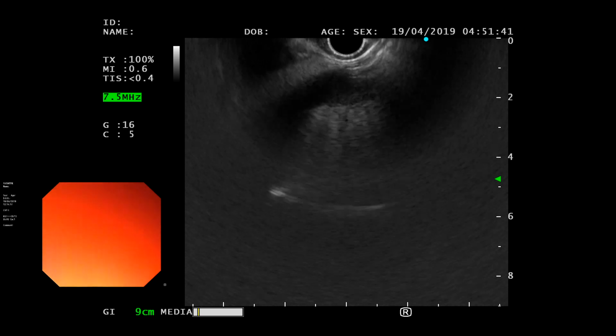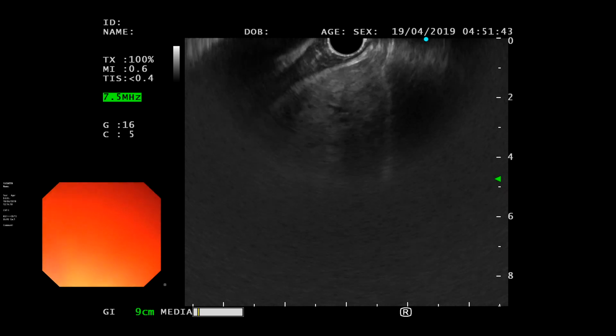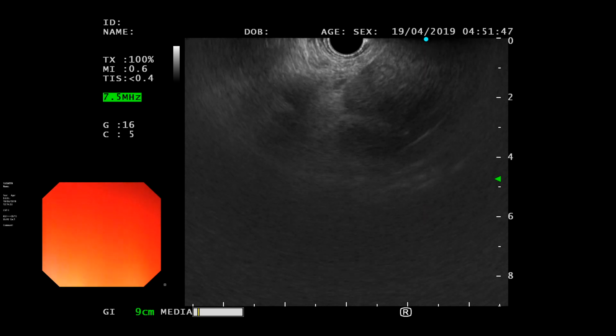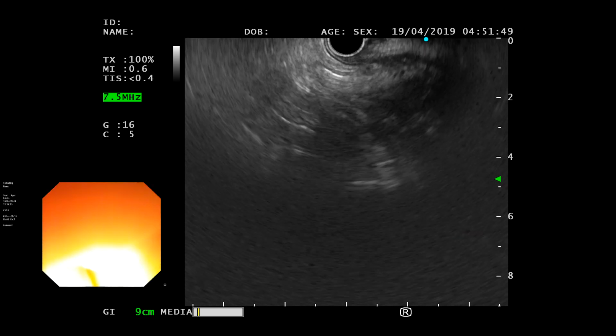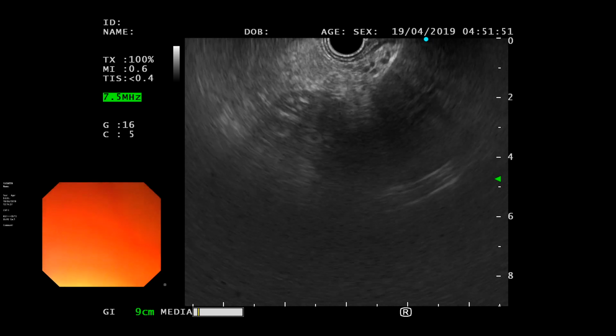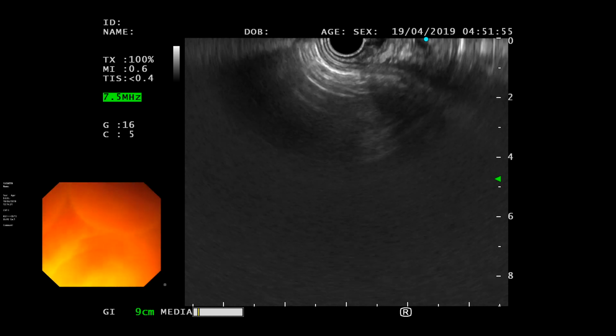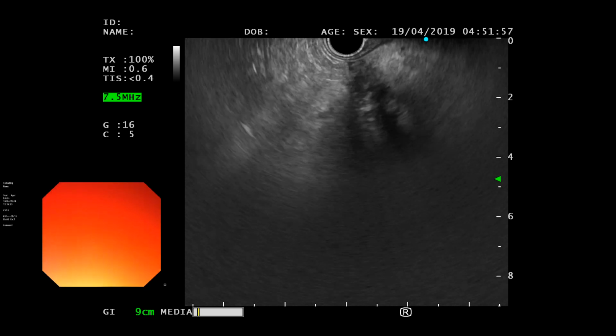I have always start from my usual place. Okay. Just the usual maneuvers. Unless I know there is a big lymph node or a big mass that I need, I would still go and start my usual place.